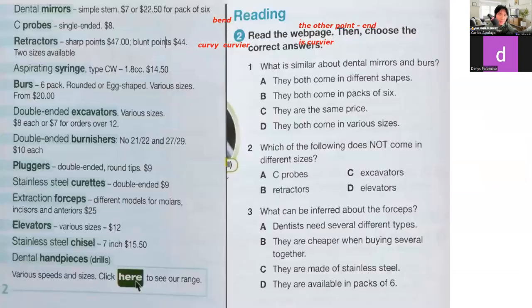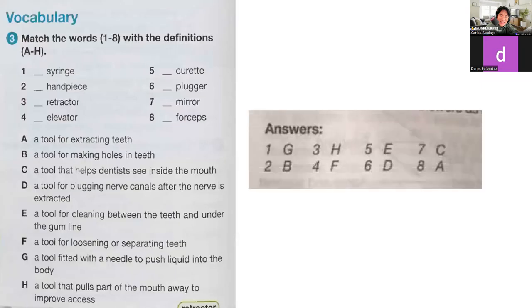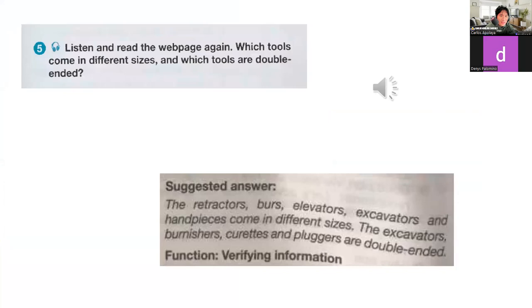I don't know if the elevator, we have it double-ended or single-ended. The elevator. Double-ended. This is the elevator. I think these tools are very old because nowadays everything improves, and some of these dental instruments might change over time, right? For example, this elevator is single-ended, but maybe nowadays we have a double-ended one. Like you mentioned, I just knew that the probe is single-ended, but you mentioned that you have one that is double-ended. Yeah, the majority of instruments, the probe is double-ended.